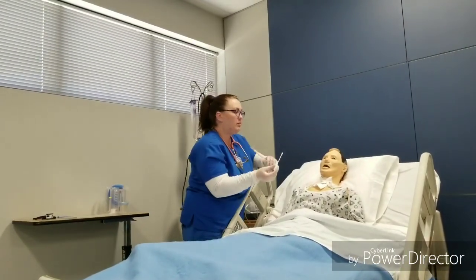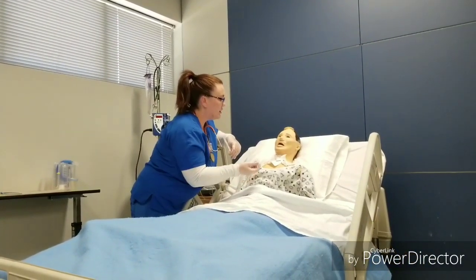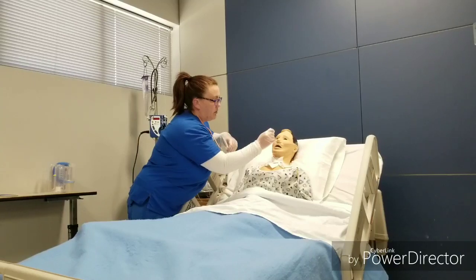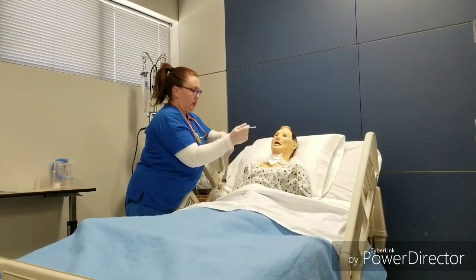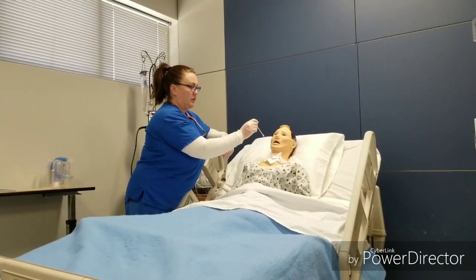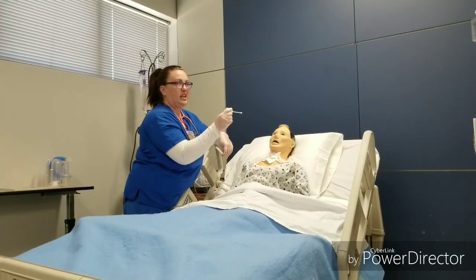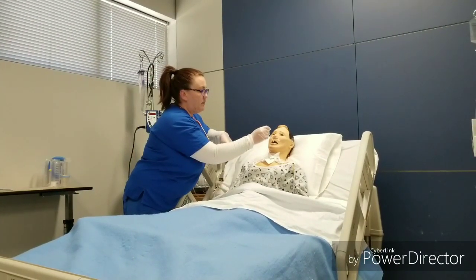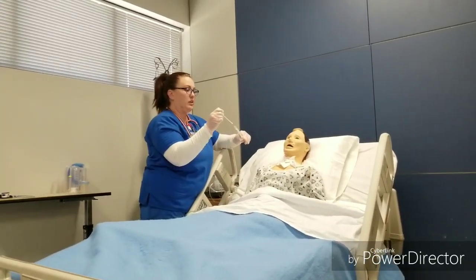You have the patient open their mouth and say ah. Mr. Smith, could you please open your mouth and say ah? When inserting the swab, you want to make sure not to touch the lips, the cheeks, or the tongue. And you will swab the back of the throat and the tonsil area, concentrating on any yucky or reddened areas. You'll swab them. And when exiting the mouth, you want to make sure not to touch anything as well.